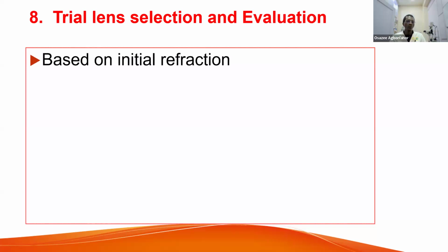These are the things you use to check the proper fit and optimized fit for contact lens. So MO talks about movement, RO talks about rotation. The first C, I think Morocco has double C's, talks about centration. Then the next CO talks about comfort. So that's Morocco, right? Then VA, of course, is also one of the things you use to check for optimum fit.